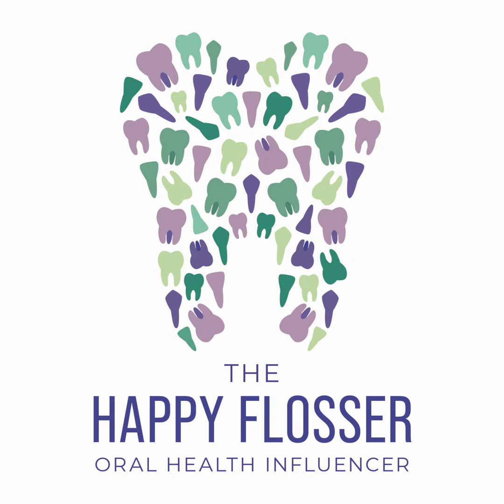Have the patient bite down gently so that you can move that image as you need to and try to get the position of the sensor in the right spot. You may need to place the sensor further in towards the middle of the palate.